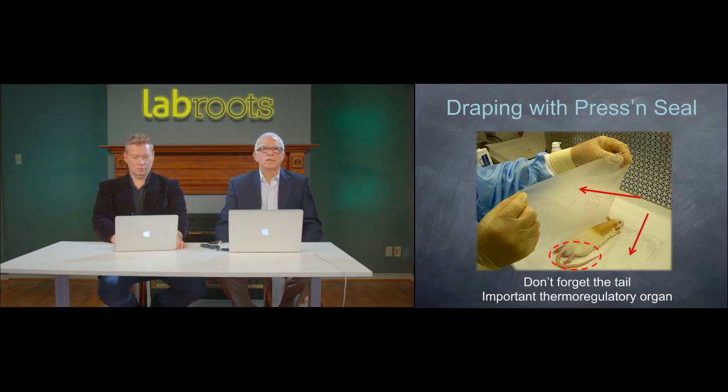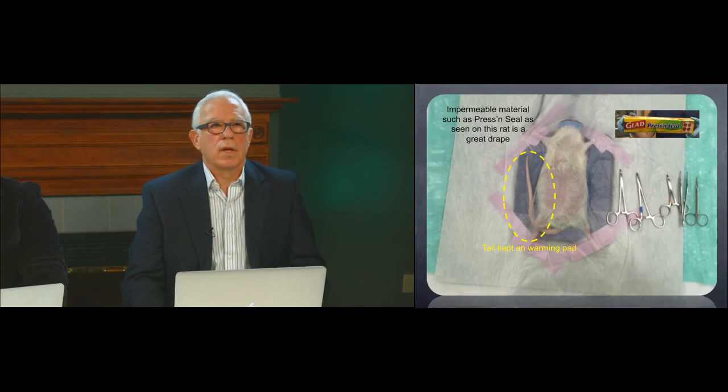Right here is another picture. Look at it, everything is in place on the sterile field. Look at the tail, it is incorporated into the heat pad, which is underneath the animal, and it's under the press and seal. So we'll give this a smiley face. There you go.